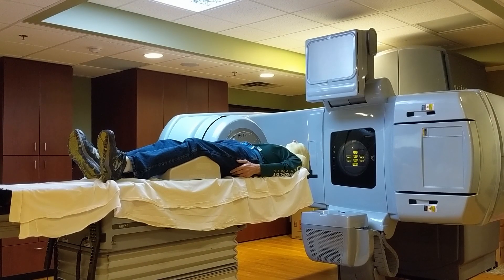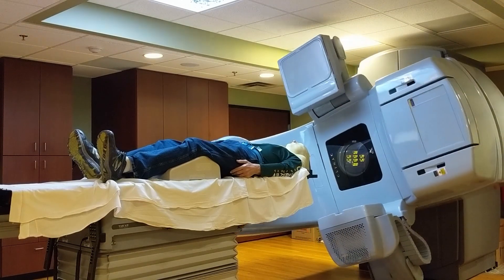What you're seeing now is the head of the radiation device. It has little pins in there that can shape the radiation so it only hits the areas that they want it to hit.